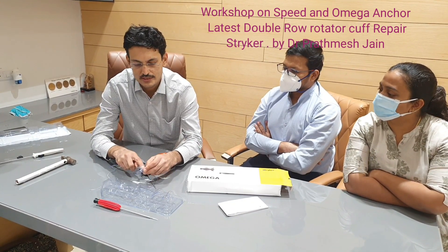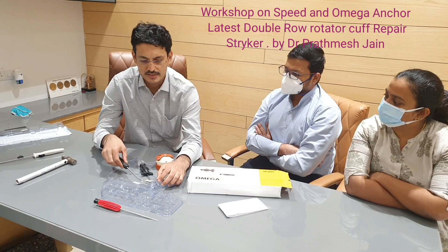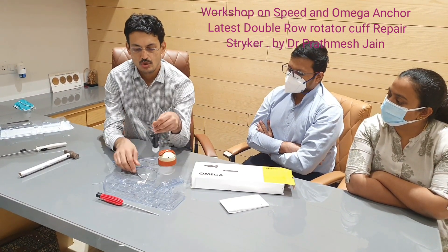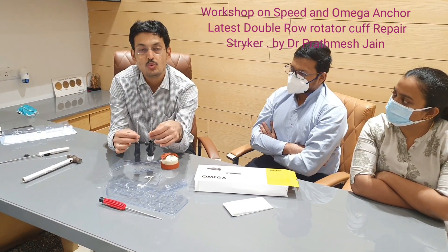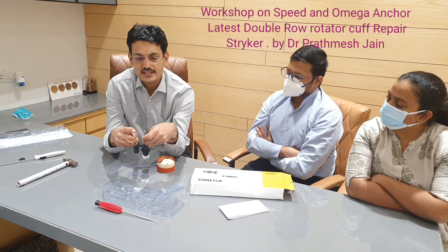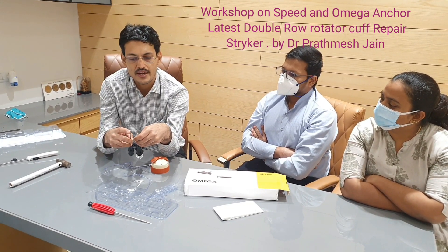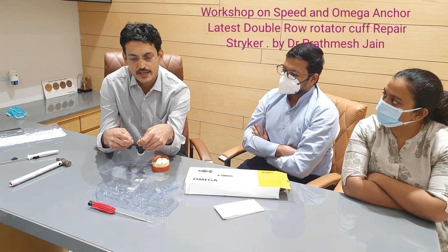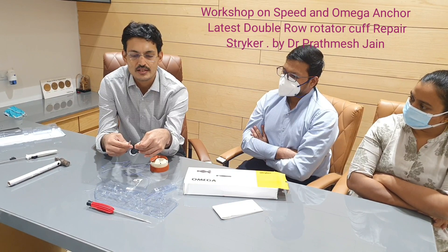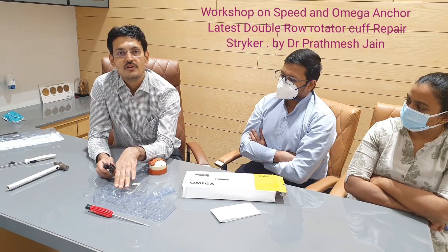Pull it like this and the first part of the anchor is reloaded. Then you can use this one to reload the second anchor. So in one sterile packing you get two anchors ready-made. The advantages: no separate punching required, no separate inserter required, maximum six sutures or suture tapes accepted, and one packet provides two anchors — so the whole lateral row can be completed with one set.